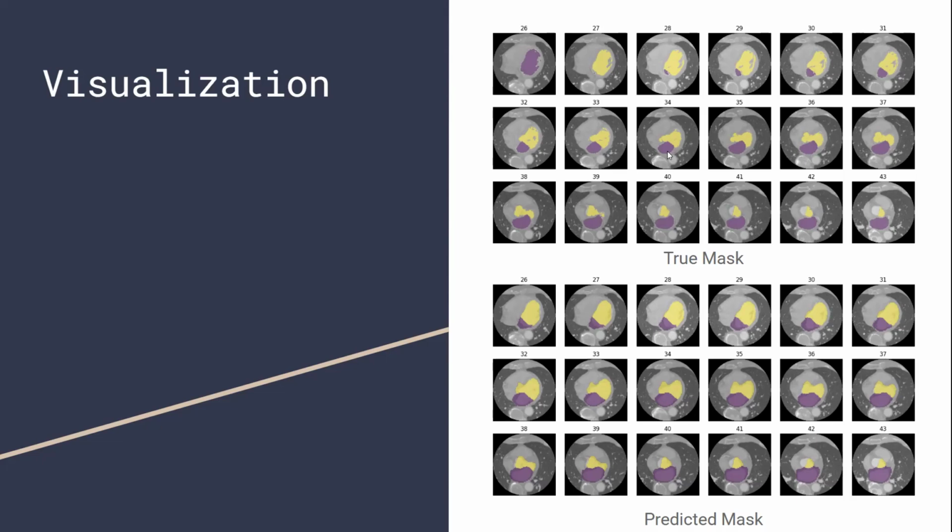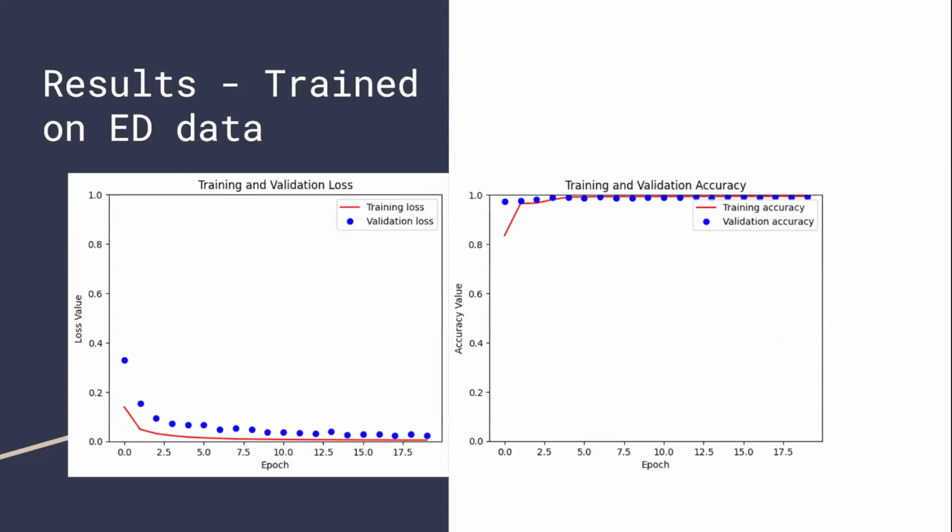So these fields of view that you're displaying here, that's the original field of view in the image you were using? Okay. So the heart is a significant part of that field of view, right? The ventricle is probably a tenth or something, but it's not 1%. It's the whole image.